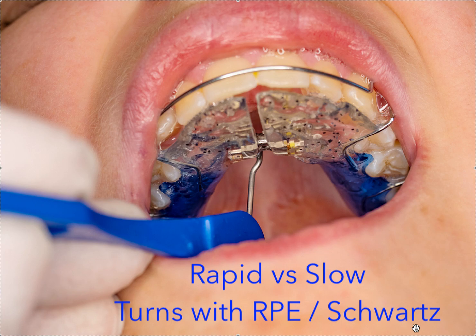And I think for me also, the second thing that happened when my daughter was about 8, we did expansion on her, a Schwartz. I started on rapid, and the amount of discomfort she had was really high. After doing it for so many years as an orthodontist and not realizing what it was like as a parent, I really changed the ways I did things. And yes, it maybe takes 3 months instead of 2 weeks, but less discomfort, less side effects, doesn't look as ugly, and less risk. Because what are the risks? Well, sometimes, first of all, if the patient is wearing inconsistently, you're not going to get splitting of the suture.